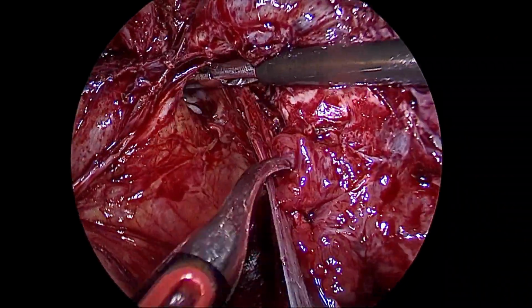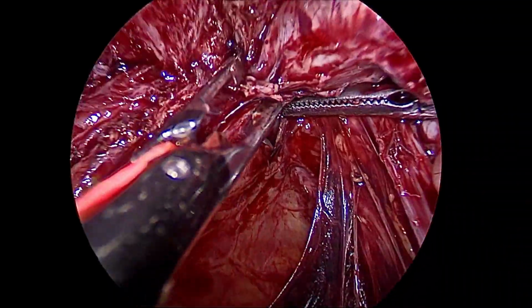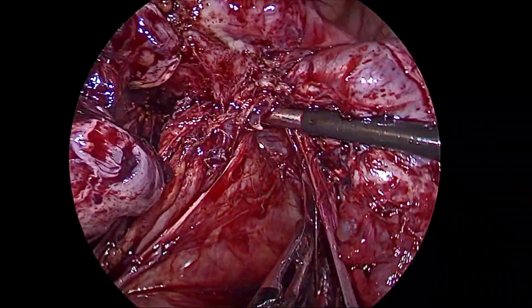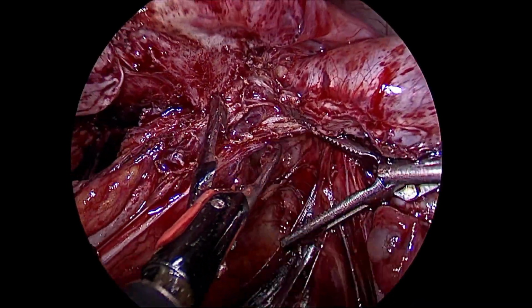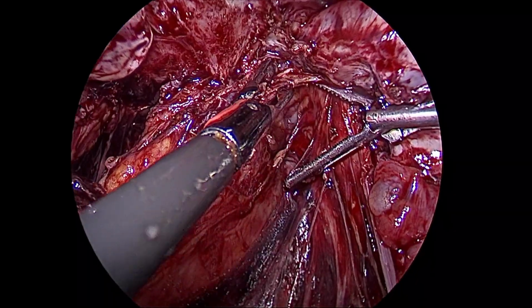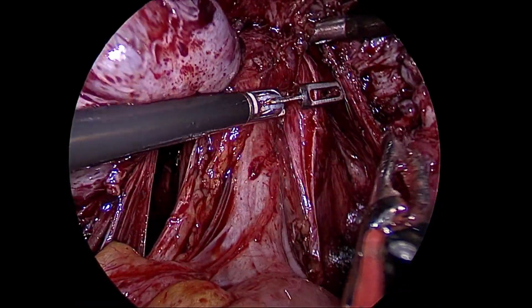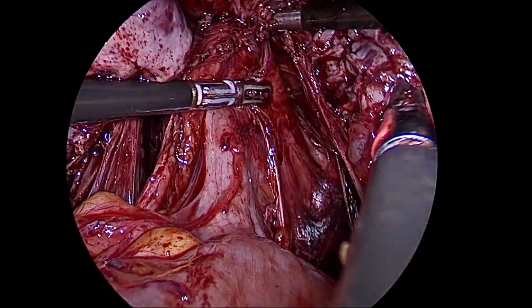Here, as we see, we've now reached the POD space. A nice space has been created. With bipolar shearers, we will be cutting off these final adhesions, and as we did it on the left side, the bowel grasper is used to create the space between the bowel and the posterior surface of the uterus and the POD.